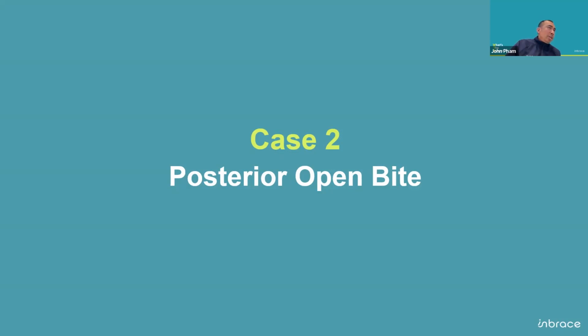Now, another doctor asked, we use membrane retainers post-treatment, but we noticed that the tissue is very inflamed. So we hold it in an Essex for 6 weeks or so. Would you recommend settling elastics during this time?